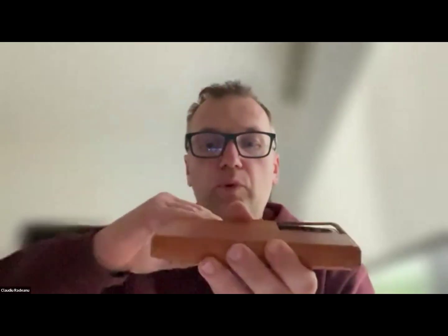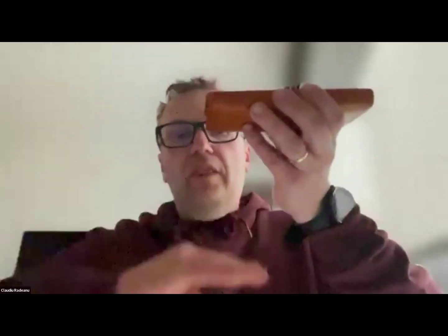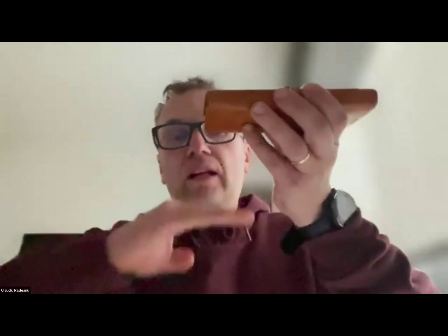Once you hit air, it bounces back. You have the pleura, that is the image, and then it goes again, and that creates the depth. So you have an A line here, and then it goes again, bounces back, and you have another A line. So you usually have about 2 or 3, and then it loses the intensity.